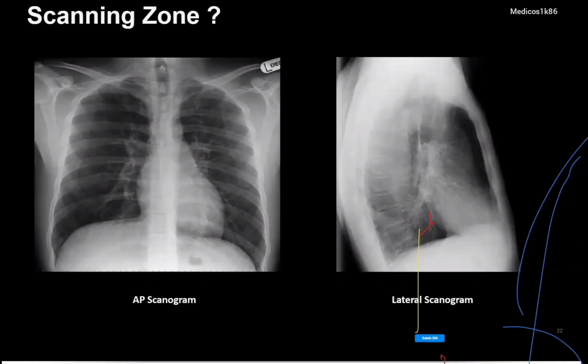This is the reason, but I'm not telling you to scan a big range, because on the cardiac acquisition, when you go to the ECG gating scan, every rotation increases the dose. This is the reason we should scan as small an area as possible, to decrease the dose. If you ask me how much the dose increases on the cardiac, if you compare chest acquisition and cardiac acquisition, the dose is going to be minimum double or triple. And it depends on the patient size.